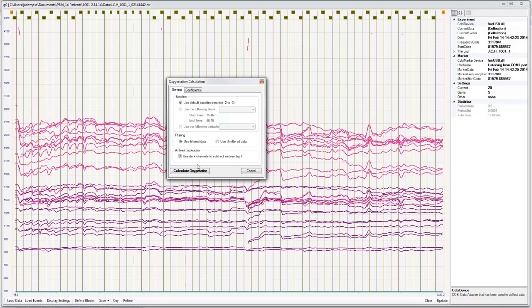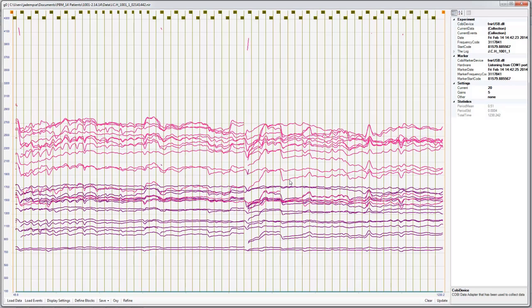That's when our pulses, our light, our probes are not on, but our sensors are reading how much light they're getting. So that's going to remove any ambient light or light from the room, windows, overhead lights from your signal. Don't worry about the coefficients. Just click oxygenation.